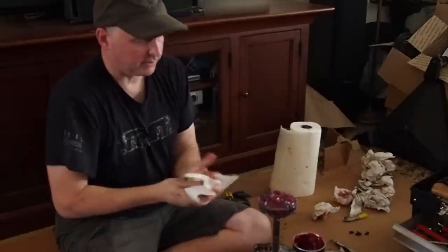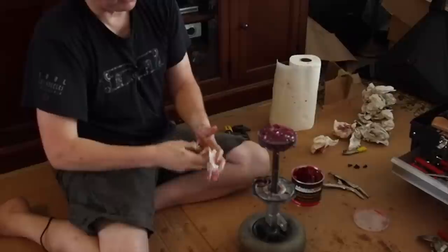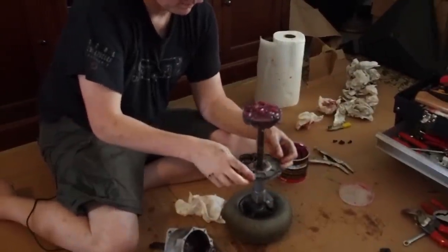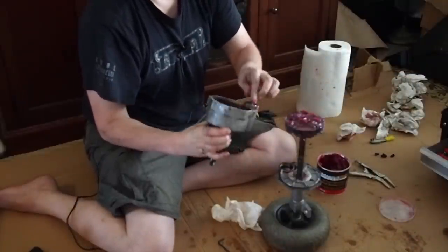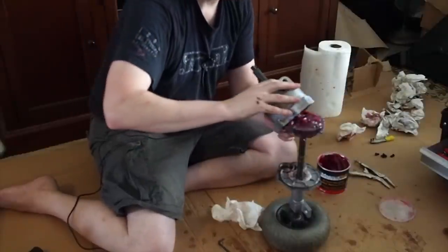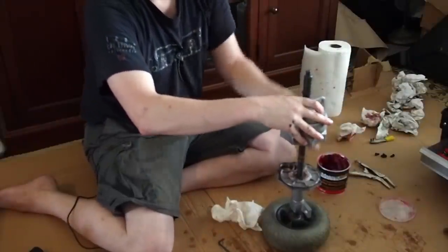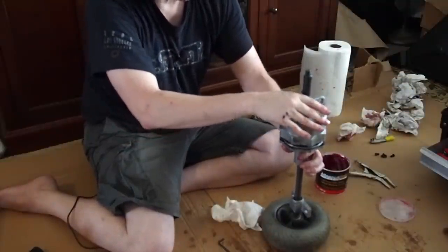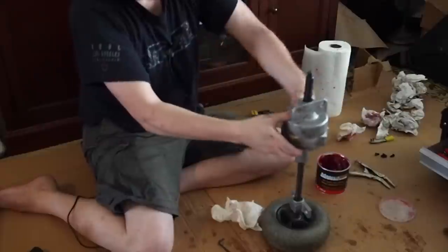This goes together pretty easily. Like I said, having the wheel here kind of makes for a good little stand. All I have to do is, so it already has the paper washer. All right, so this worm drive gear, with this on here, I like to push it in there first because it's kind of hard to get in otherwise. But with that on there, I kind of have to tilt it on, and then you can get this whole thing on there like that, and you can feel that it turns. Push that up into there. Just moving the grease around, and it should go together pretty easily, like that.